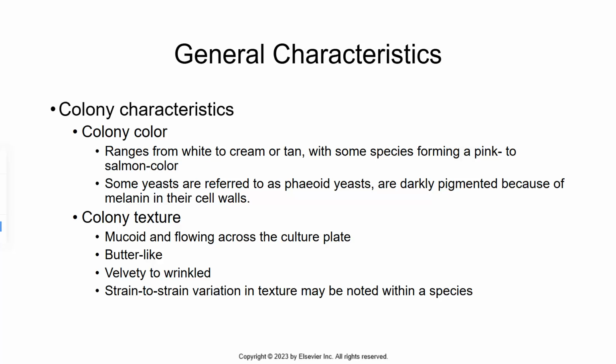within a species. So yeasts kind of look similar to bacteria. Like when they grow on a plate, sometimes they look like bacterial colonies. There are some differences. A lot of times yeasts will grow wider and larger, and then microscopically, yeast cells are much larger than bacterial cells. When looking at them microscopically, yeasts sometimes are more oval shaped than round. You wouldn't typically see perfectly round yeast.